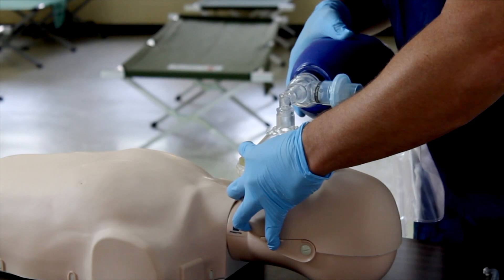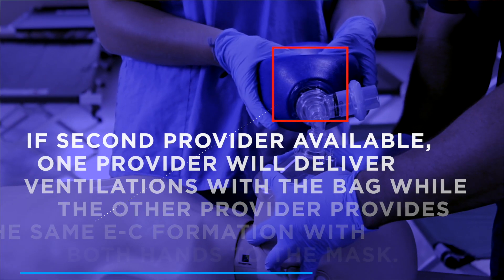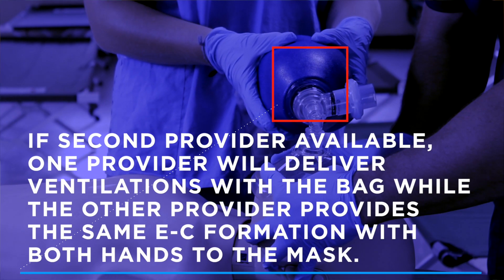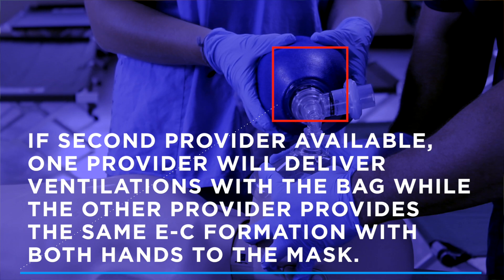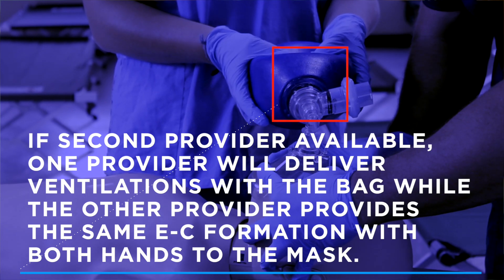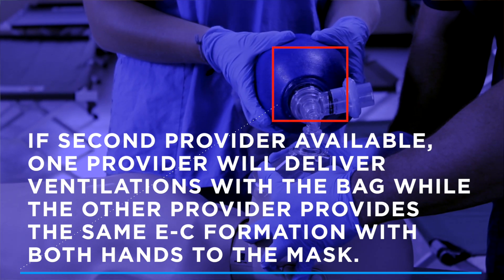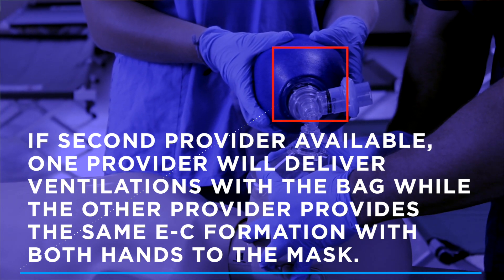If a second provider is available to assist with bag mask ventilation, one provider will deliver ventilations with the bag mask while the other provider provides the same EC formation with both hands to the mask.